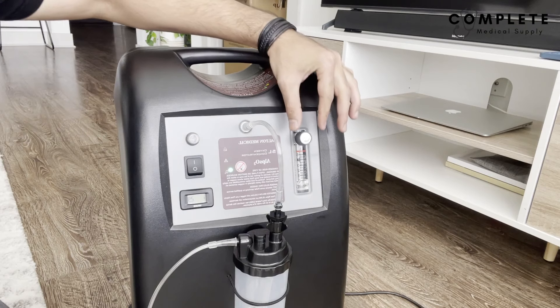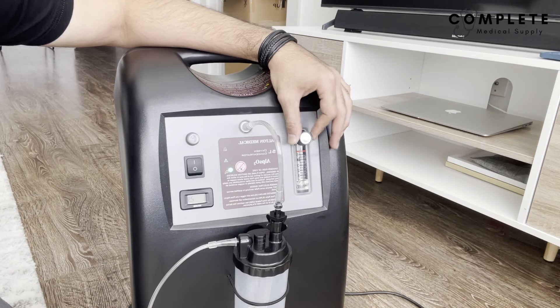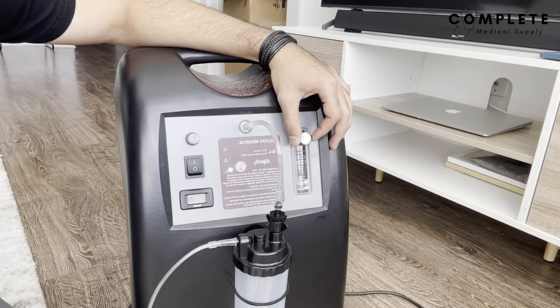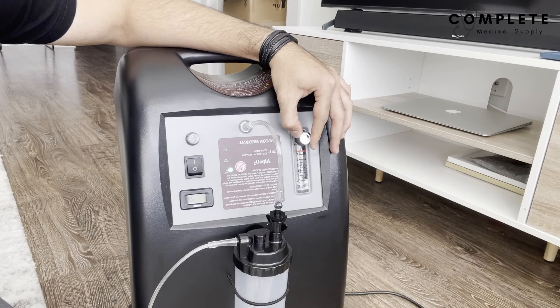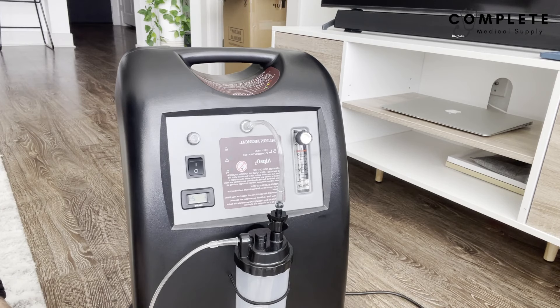The last thing to do is adjust the liters per minute — this knob goes all the way from one up to five. When you're done using it, turn it completely off and store it in a room-temperature place, away from any smoke or anything harmful. Now that we know about home concentrators, let's unbox the portable and see how it's different.